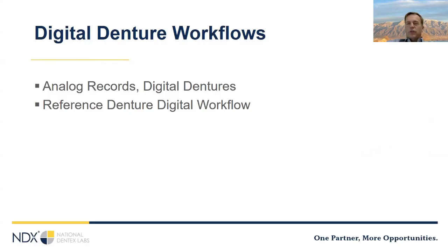So how can you do digital dentures? You're like, well, I don't have an iOS, or I'm not very good at scanning dentures, or scanning dentures is hard, or whatever. How do I do it? Well, what's cool is that you get the most benefits from the digital denture process if you use your iOS scanner. But if you take a really nice border molded impression, you can have all the advantages of a digital denture while doing the first 3 appointments using the analog process.